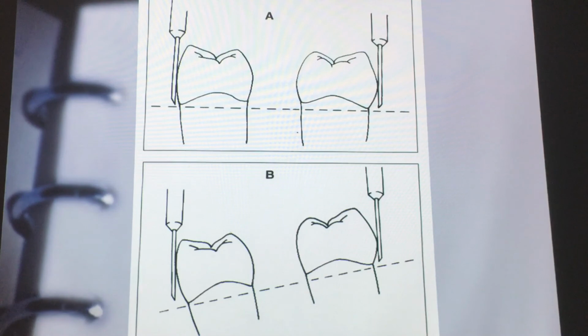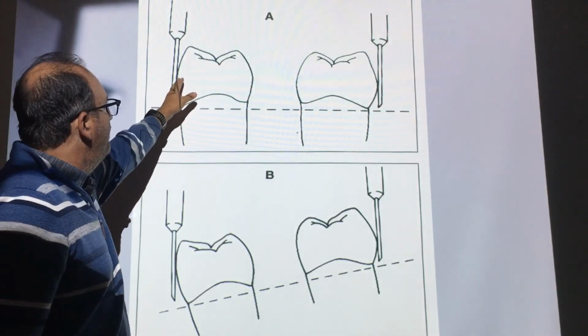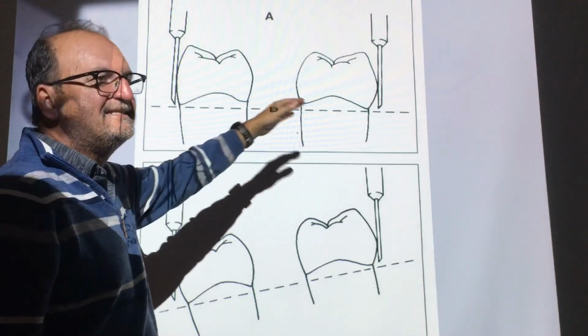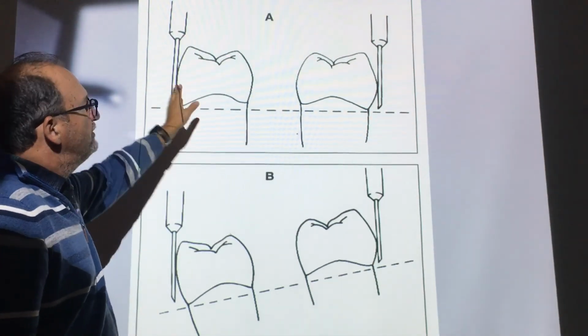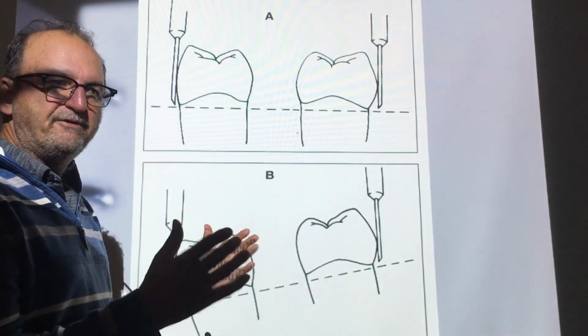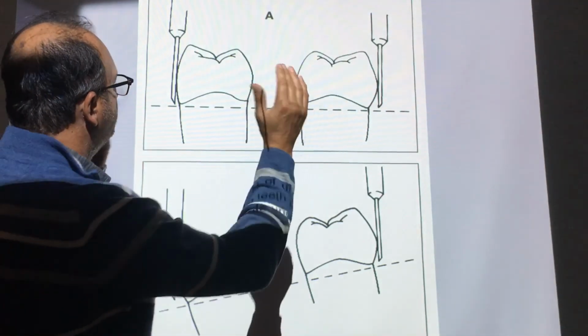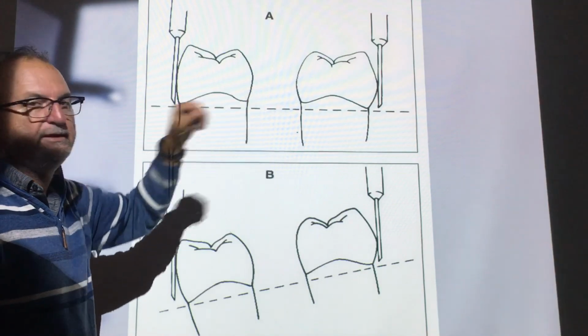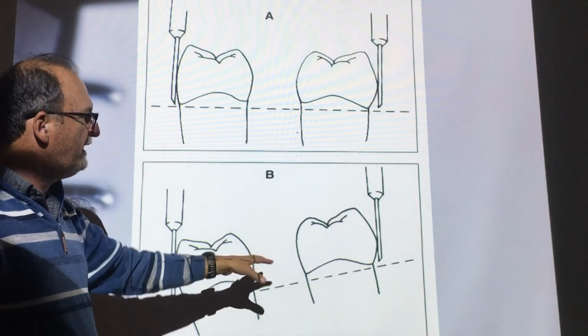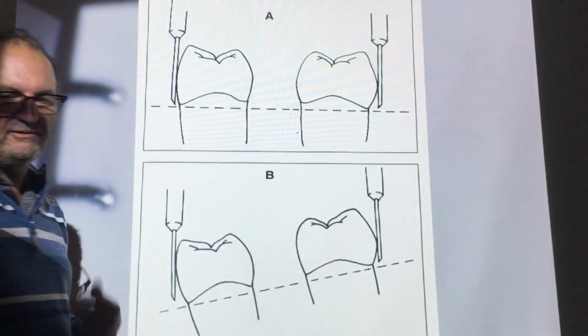We're going to use our analyzing rod, and we're going to recognize where the height of contour is, left and right, and then we want to balance it by moving our survey table left and right. I'll do this in the demonstration. You will do it as well. So the height of contour on the buccal of the 3-4 is similar to the height of contour of the one on the 4-4. The undercut between the gingival margin and here is roughly around the same height as there. The shape might be different, but the height of contour is around the same place. So aesthetically, when we're looking at the client, the clasps finish around the same part of the tooth. We don't want one way up high and one really down low. And we can change where the height of contour is by the angle of the table, which we're going to do.